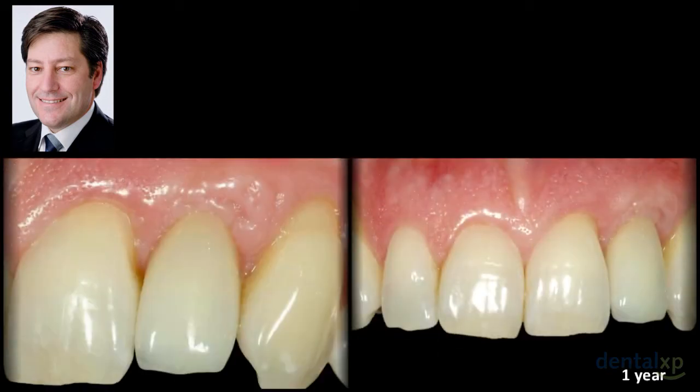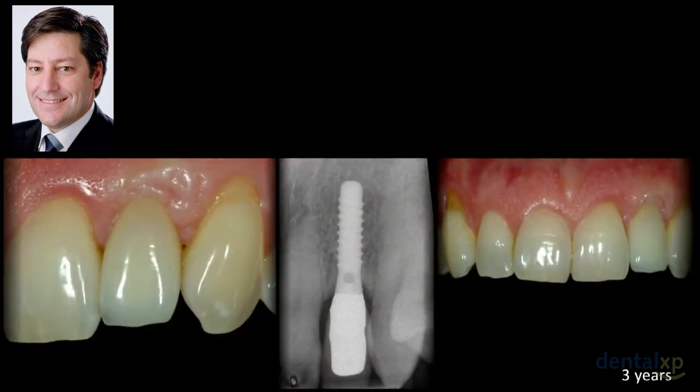Then, I'm happy to show you here, this is the 1 year follow-up. Everything stayed in the same situation, the patient is happy, and we maintain the levels. The prosthesis is still intact and functioning, and pretty much we have covered all the aspects of the success criteria. And you can see the same case at 3 years follow-up.